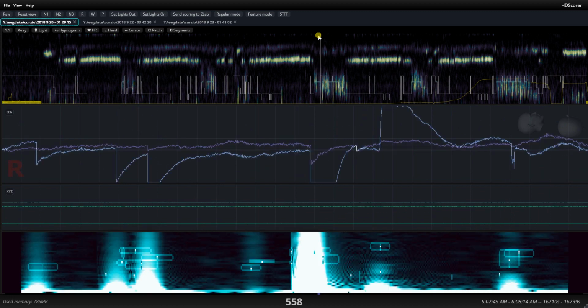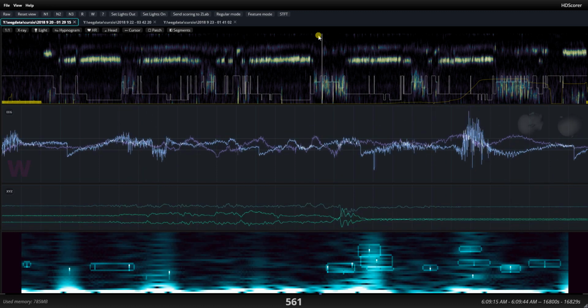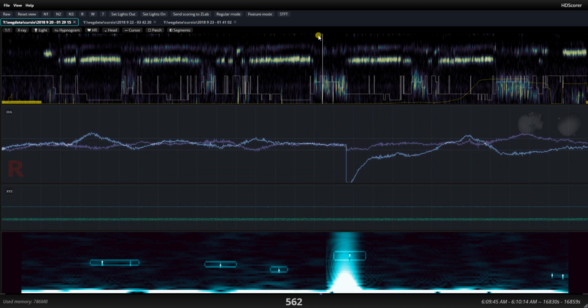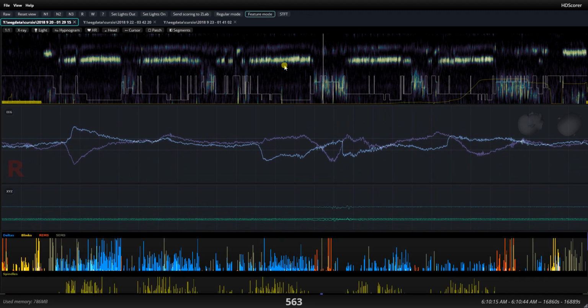I don't know what that kind of spike is, so it might have been thrown off by that. But here there is a movement, so that would be fine. And then we're back in REM, very strong evidence of REM. Remember that you can go and look at the orange stuff.